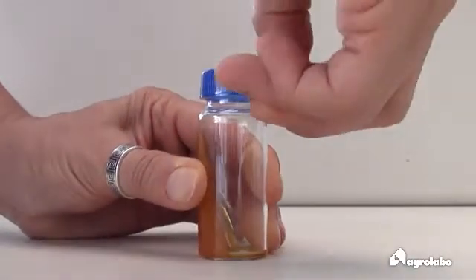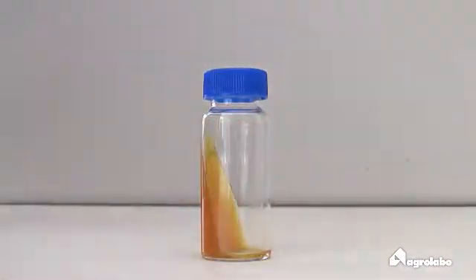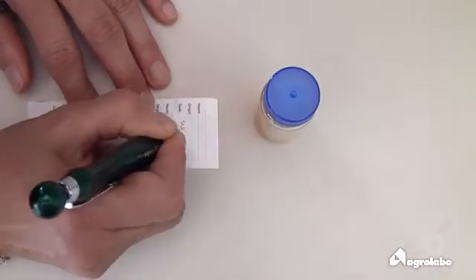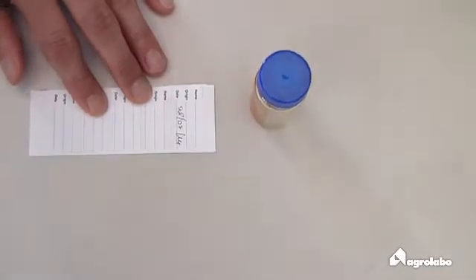Place the vial on a flat surface, remove the protective sleeve and open the cap. Add the label with the sample data such as name, origin, date.